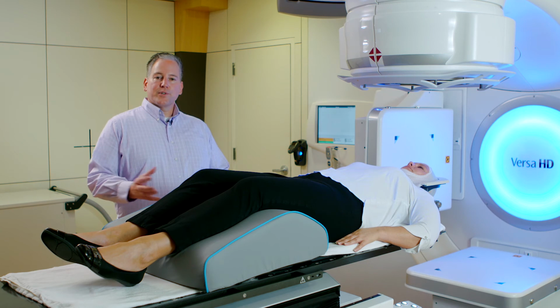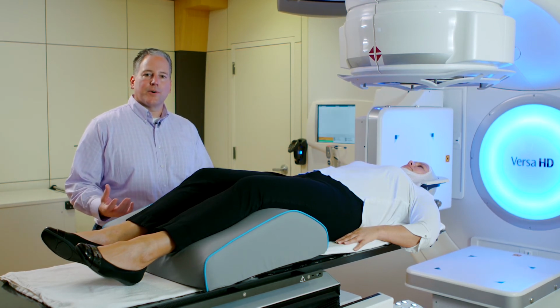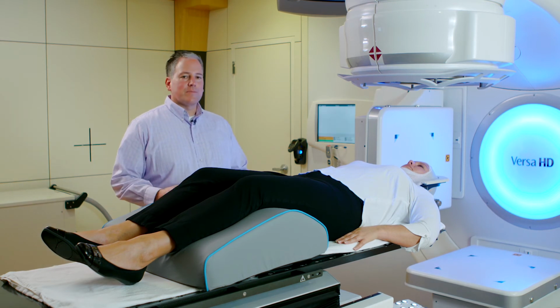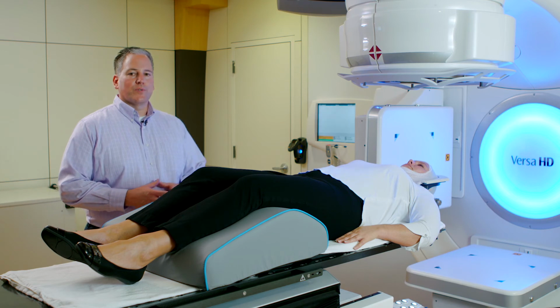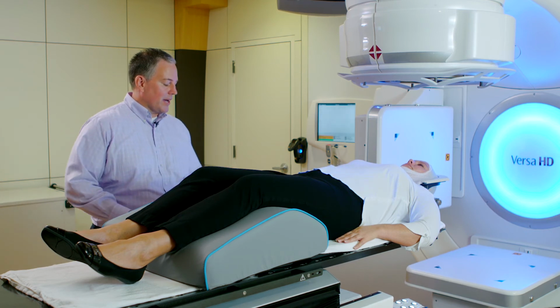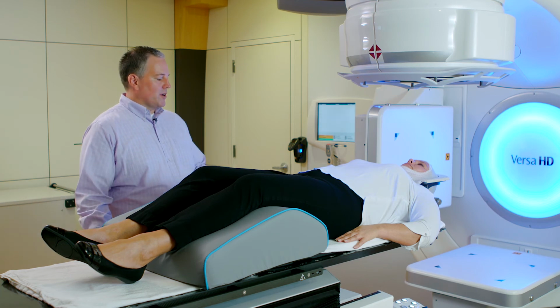Now that we've delivered our first beam, our second beam is actually going to be non-coplanar. So we're going to have a couch kick on that beam. The Catalyst system is directly synchronized with your delivery system. So when you pull up a field with a couch kick, we're going to know that exact couch kick, and we're going to let you know when the patient's properly positioned. You can auto drive the couch.